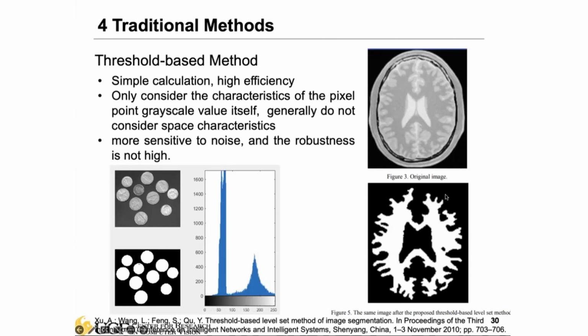Here, we'll just select one threshold, so we generate a binary segmentation mask. As you can see, we're able to generate a very rough segmentation map. You identify some of the structure of the brain, but not in great detail. If we want to classify gray matter or white matter, or these fat tissues, we are not able to clearly distinguish these different classes, but overall we still get a rough structure.